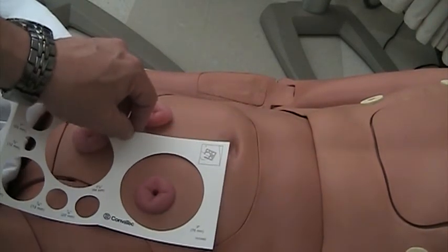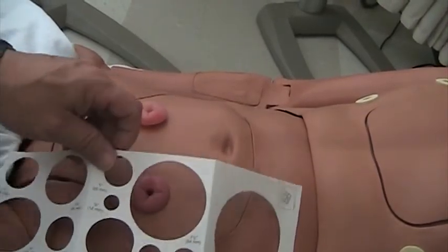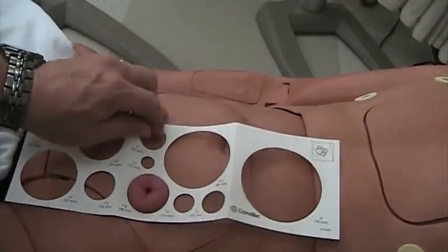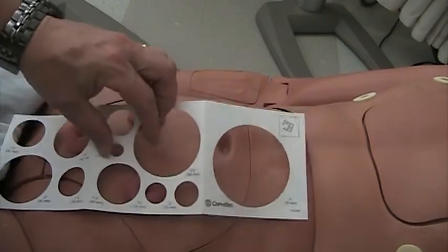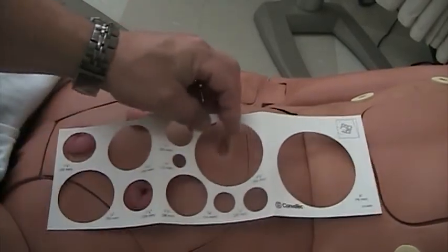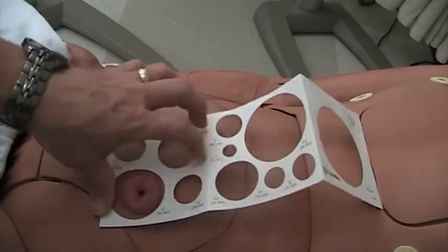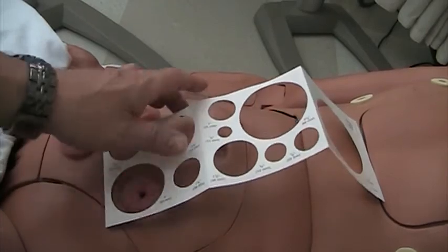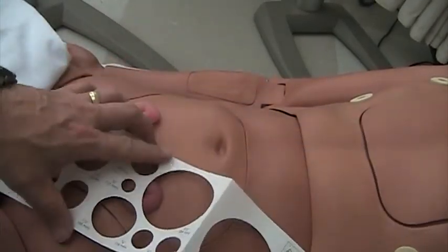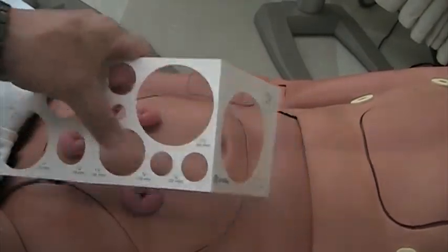You can see that that's way too big. So what you want to do is fit it where it's right around the stoma, but not onto the stoma. So it looks like that right there would be a good fit. You can tell that this one's too small, as well as that one. This one's a little bit too big, because if I'm leaking stool onto the skin around it, it's going to irritate. So it looks like that one right there is the correct size. Alright, so I'm going to remember that.